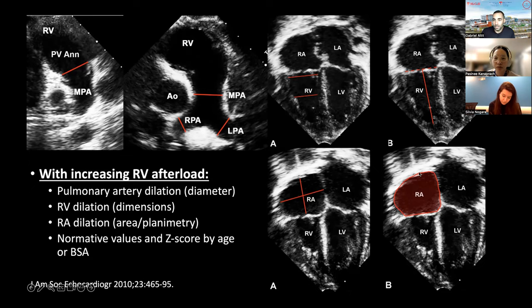Valve closed. But the difference between here and here is that this view is at the peak of systole, when the RV is completely contracted. Why is it systole? It's because that's when the atria are completely filled. You remember we said at the beginning in parasternal views, when you're doing the left atrial diameter, you're doing it in ventricular systole because that's when the atrium is completely filled.